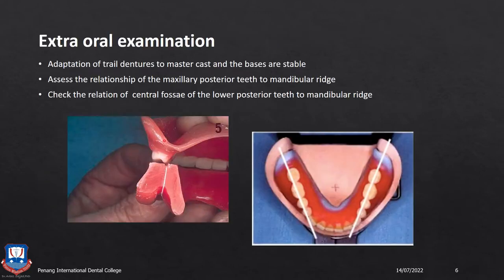Extraorally, you examine the denture flanges for fullness. You examine the finishing of the wax setup of the denture teeth. There should be no wax on the teeth. It should resemble a final setup that needs to be acrylized and finished.